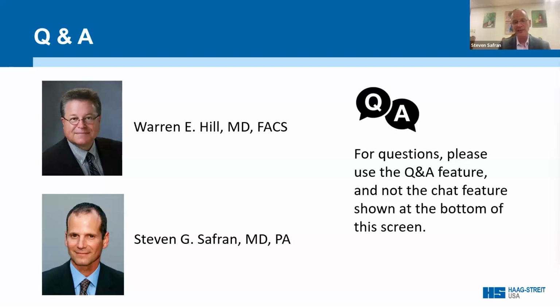And in my practice, I tend to like to overcorrect against the rule of astigmatism a bit, and I tend to undercorrect with the rule of astigmatism even more than Barrett formulas and the Koch Abulafia formula would suggest to do, because patients are going to go more against the rule over time. So I like to sort of plan ahead for that, and I tell patients it's sort of like setting a watch that's losing time a little bit ahead so that it goes right past the perfect time, and 10 minutes instead of being 5 minutes behind, it's 2 minutes behind. So, that's sort of the way I like to do it.